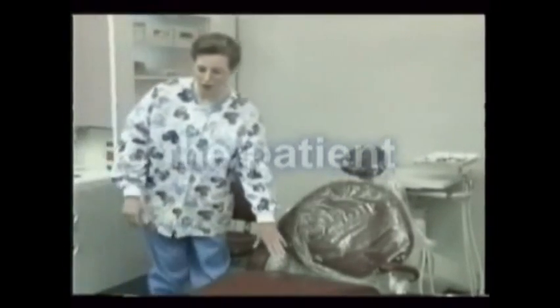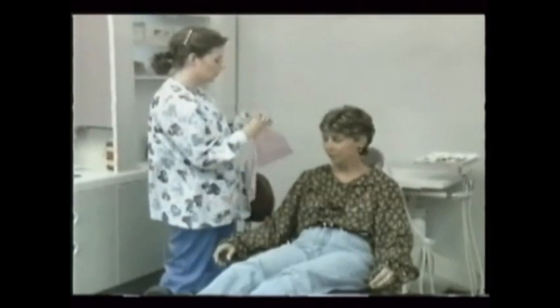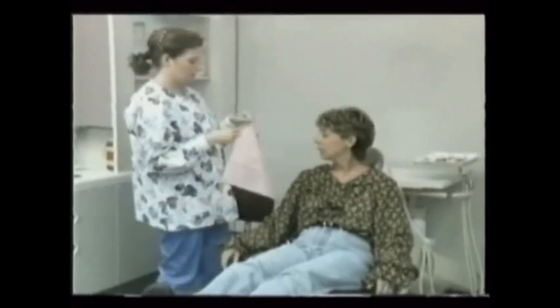Once you're aware of the planned treatment, have gathered and covered the materials needed, prepared the treatment room, and placed the x-rays on the viewer, the patient may then be seated. The patient is seated comfortably, and then properly draped and positioned in the chair.